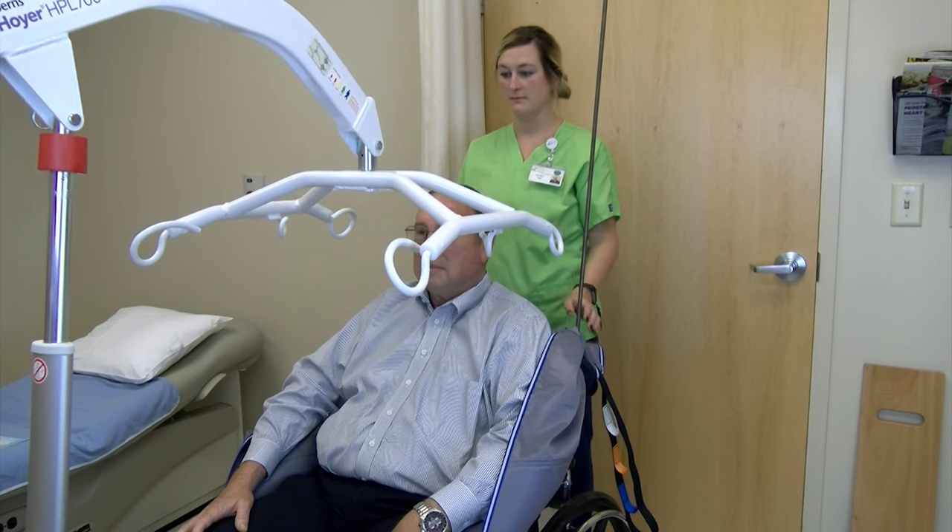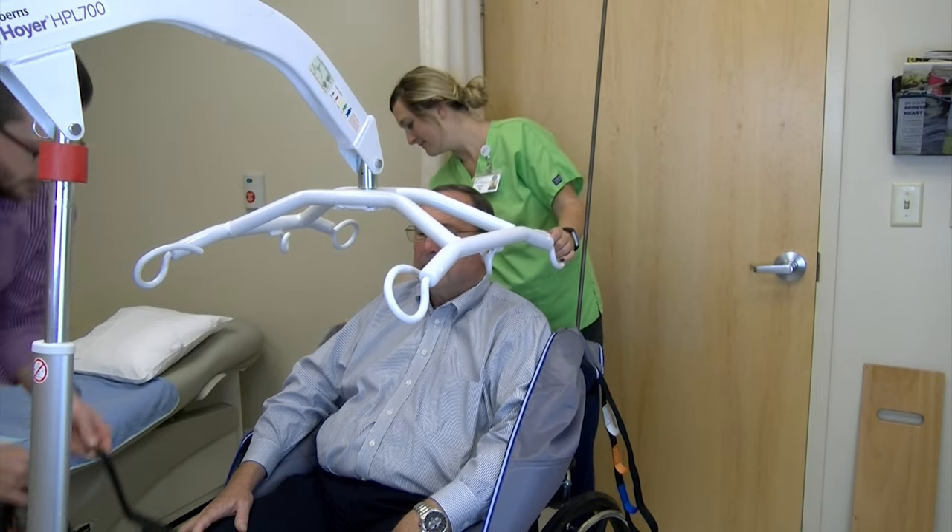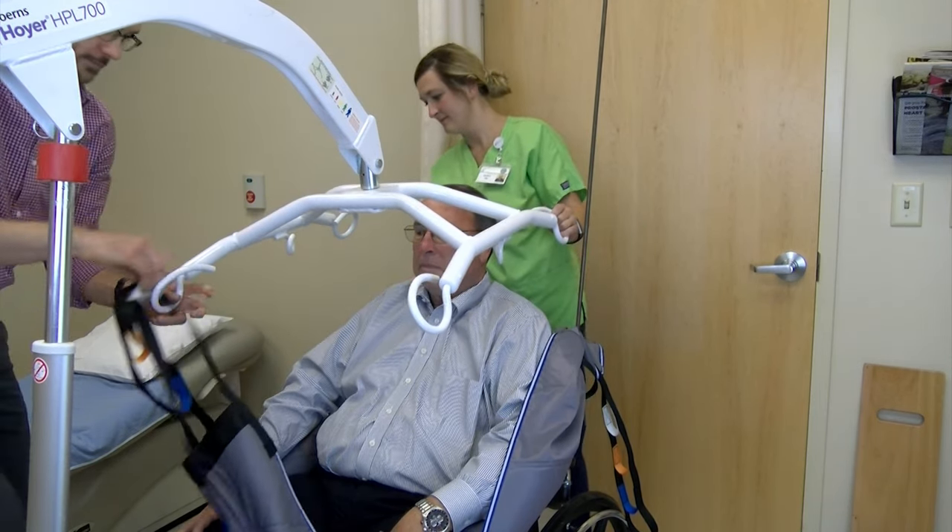Attach the straps of the sling to the sling bar. Don't forget to criss-cross the straps under the patient's legs, and make sure that the straps by the patient's legs attach to the front of the sling bar.